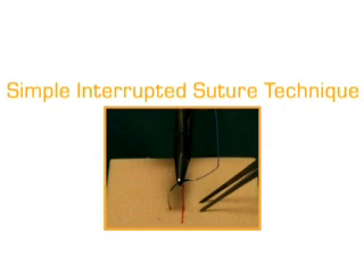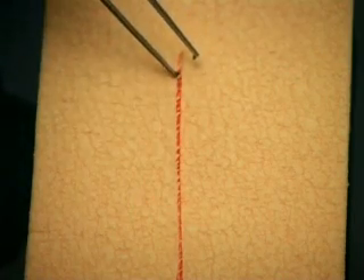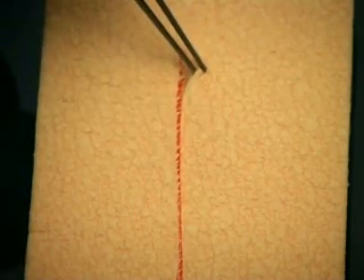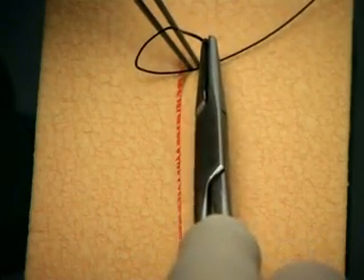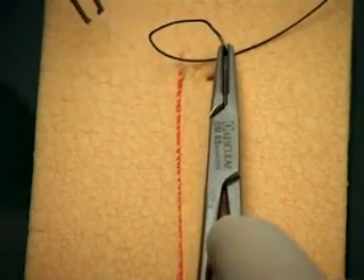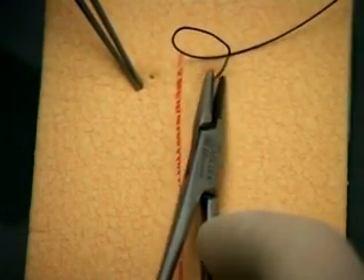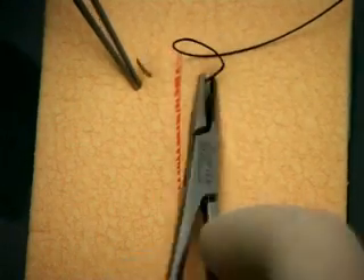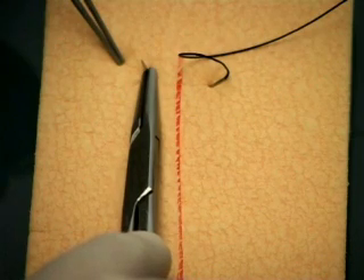In this segment, we take a look at the simple interrupted suturing technique. Start on the side of the wound furthest from you, so that you are suturing towards yourself. Hold up one edge of the wound with the tooth forceps. The point of the needle enters the skin at right angles, at an appropriate distance from the wound edge. Drive the needle through by a rotatory movement of the needle holder, recreating the arc of a circle.